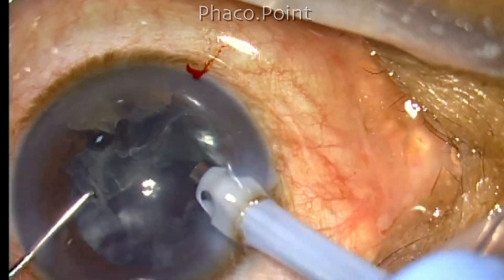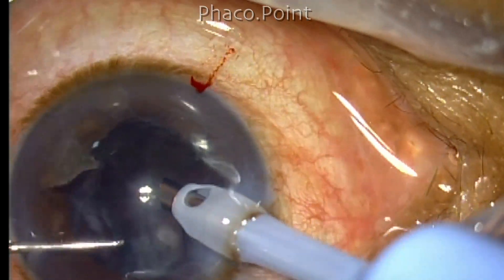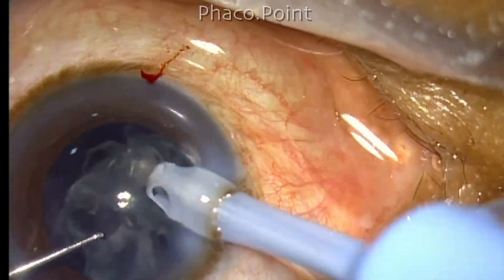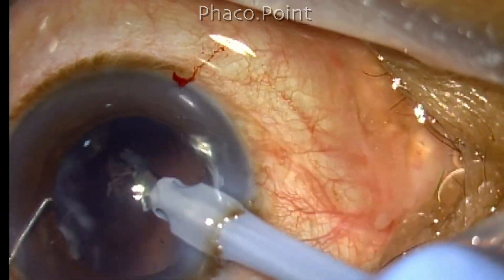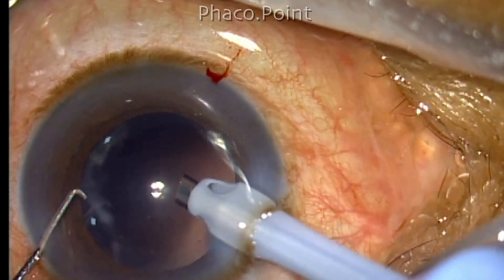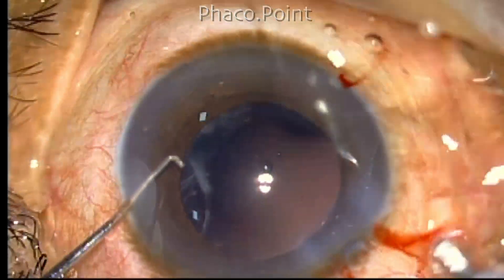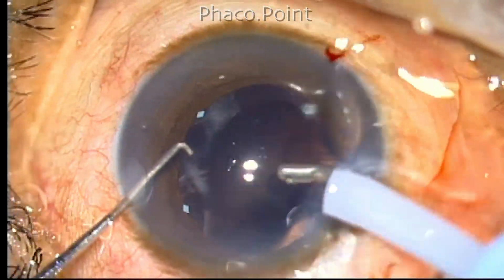After removing the nuclear fragments, I am left with a thick epinucleus shell, which must be removed very carefully. I am collapsing the shell by passing the Sinski hook underneath it and gently lifting it. While doing so, make sure the tip of the Sinski hook is facing laterally and not posteriorly. There is just a little peripheral cortex and some peripheral fibrosis, so cortical aspiration is then completed.